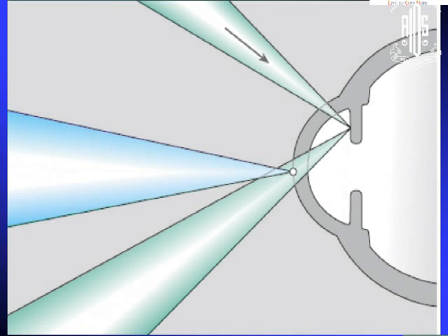So you have to disalign that, and then you can choose any angle and wherever you want to throw the light. Now in this, whatever light is coming from here, you are observing it, and whatever the field area, meaning pathology, you are seeing with this method.